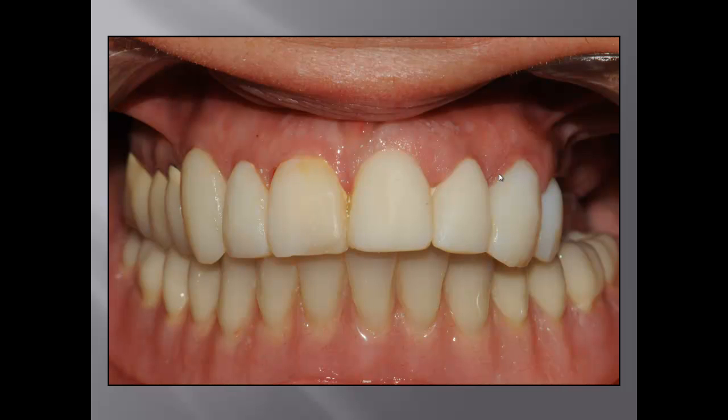So I created my temporary crowns. I didn't have a wax-up, so it was all freehand. But my point is, how can I transfer the reference point to my technician so he can create the crowns in the proper position?